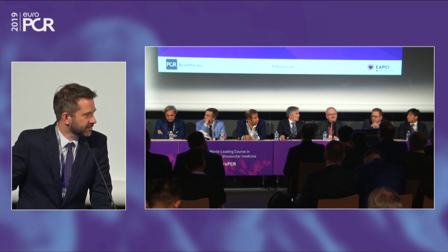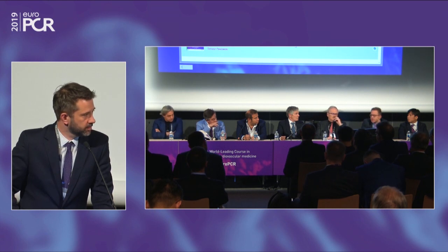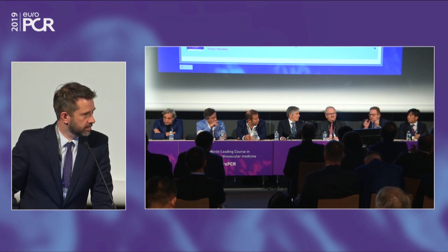We have a running time just to implement the advice for good positioning. Just avoid the position of the stent within the guide catheter. That was the case, because even a small movement of the guide changes the position of the stent. So it's necessary to have at least a part of the wire before the guide ostium. So we should avoid it.